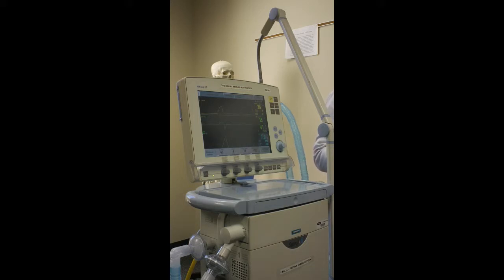That never changes. Lips can get swollen, or like, am I going to say I'm 22 here or am I 22 here? That's very subjective as to where it could be. The teeth and the gums won't change, so you should always mark it that way. So we might say 22 at the teeth or 22 at the gums. And that way when you're doing your next vent check, you should all pretty much have it the same, unless there was an order from a doctor to move it back or move it forward. If you're supposed to be at 22 and you come in and it's at 25, that is something that you should be looking at.